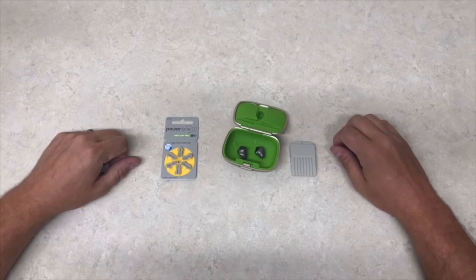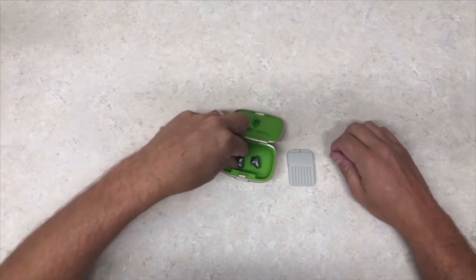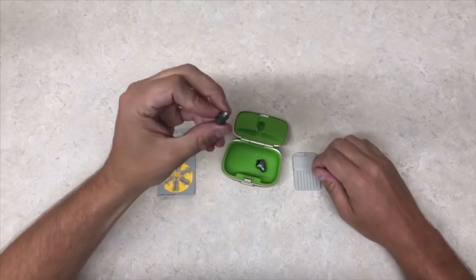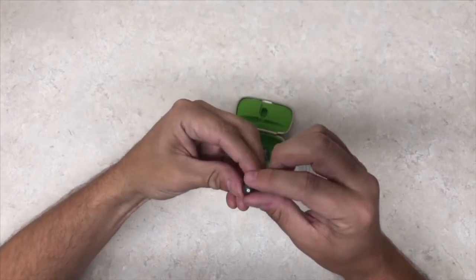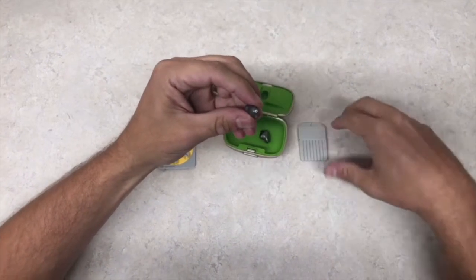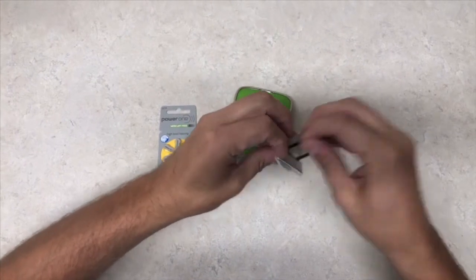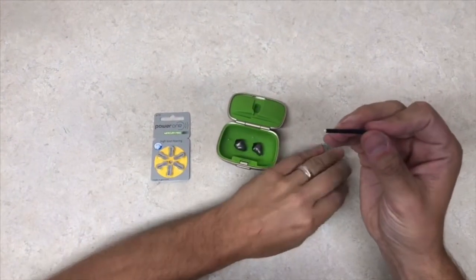One of the most common reasons that hearing aids stop working is impacted earwax. These are a set of IIC hearing aids. You can see the little white filter at the end. That's your wax trap. In order to replace the wax trap, you find your wax trap kits.